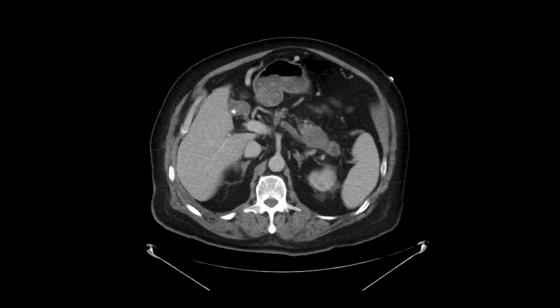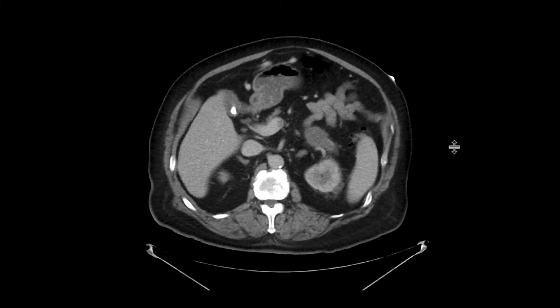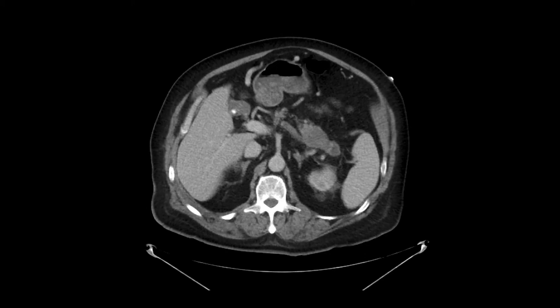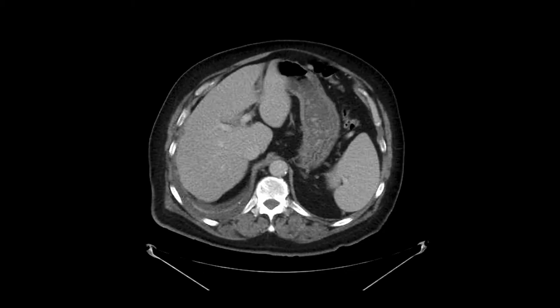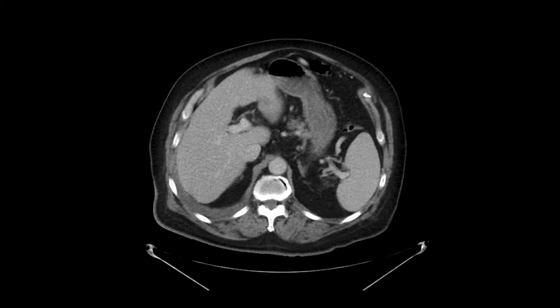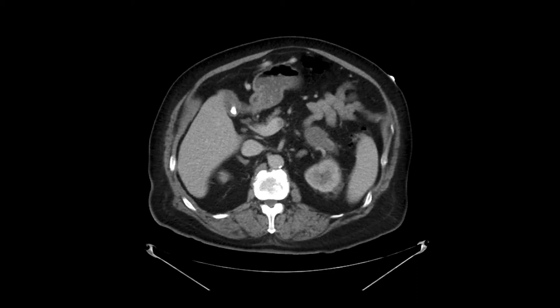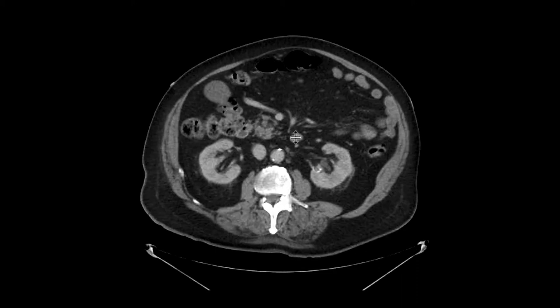If you look closely at the case, you can also see the adjacent splenic vein is thrombosed. You can see thrombus within it, and it's extending to really the portosplenic confluence. As a result, you can see this big collateral sweeping around the stomach, arising from the proximal aspect of the splenic vein as a means to return blood circulation back to the superior mesenteric vein.